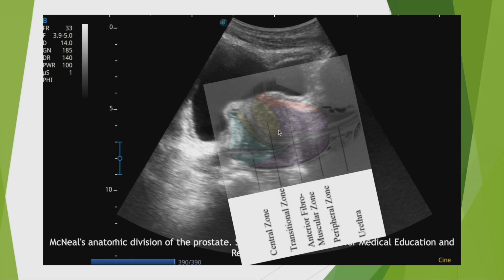Around the urethra, the part, as we shall see, that is most often difficult to explore because it is hidden by the pubis, which will pose diagnostic problems, particularly for prostate tumors, will have this peripheral zone. And along the seminal vesicles, you'll have this zone that follows our ejaculatory ducts along the seminal vesicles, which are most often well visualized on a prostatic ultrasound.